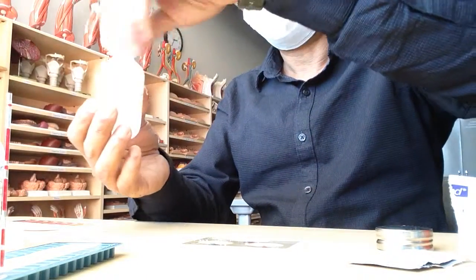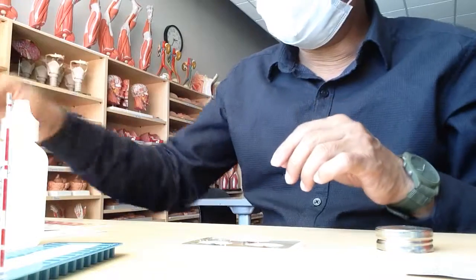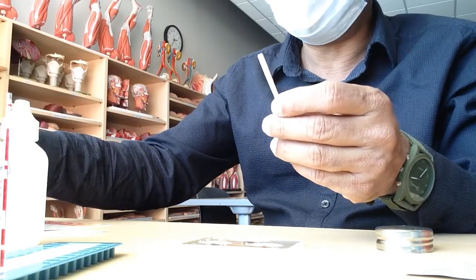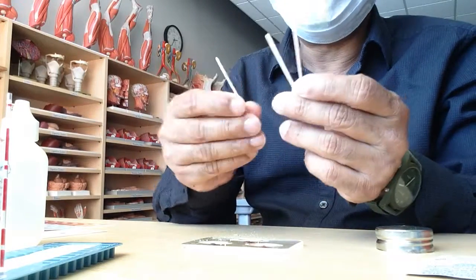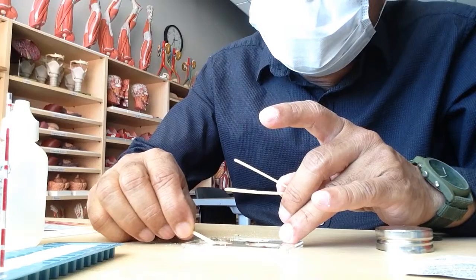Just one drop from above, make sure that you don't touch the blood. Okay, then get the toothpicks. Three toothpicks you'll need to mix the blood with the serum.